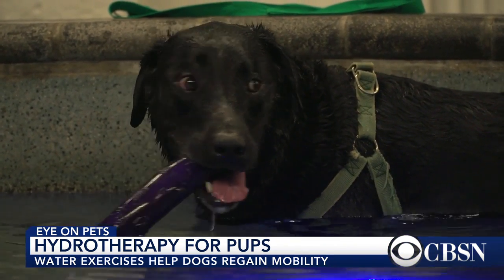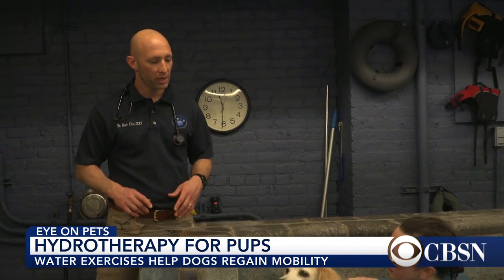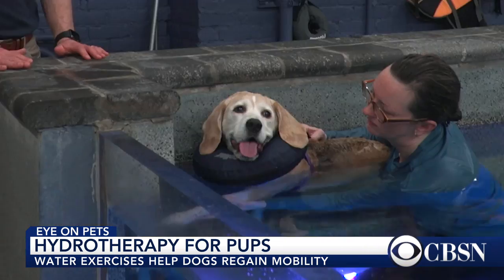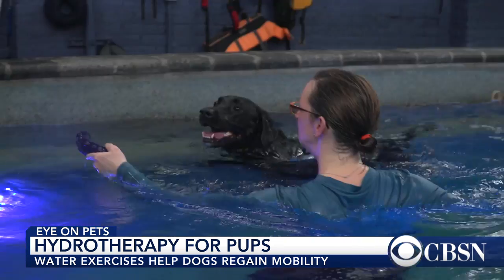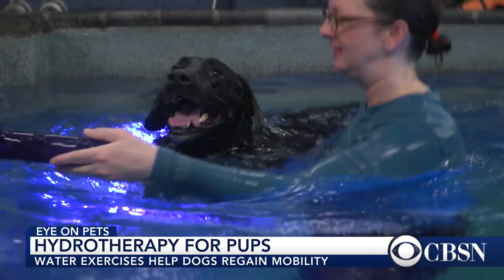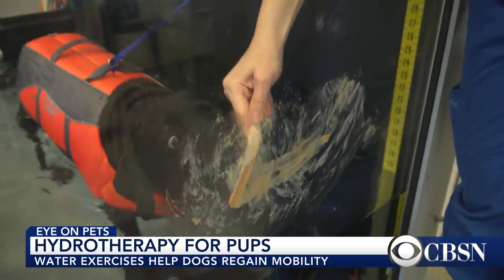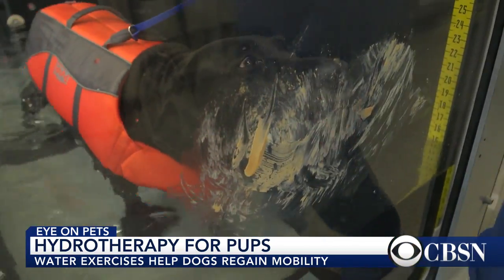We'll give them rest, but we'll use this time to give them a deep tissue massage, stretch their muscles, and work on the areas where they might be limited in terms of their range of motion. It's a form of medical treatment that dogs seem to love. Some facilities even sweeten the deal by rubbing peanut butter on the treadmill glass.